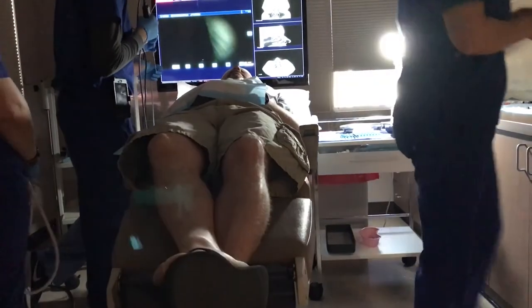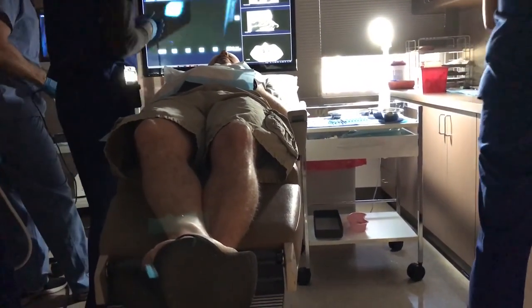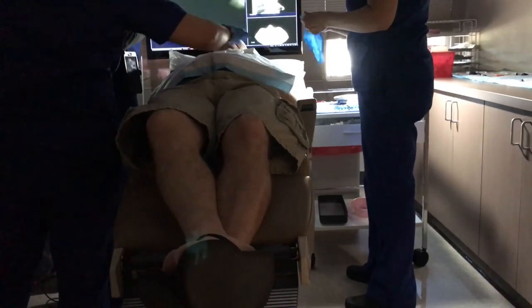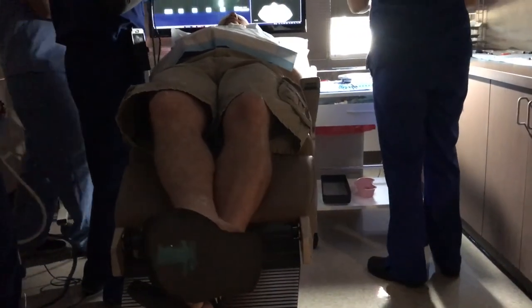So we've anesthetized everything at this point. Okay Michael, we're going to start doing the balloon work in a minute here. Yeah, I can feel the numbing down into my teeth. Yeah.